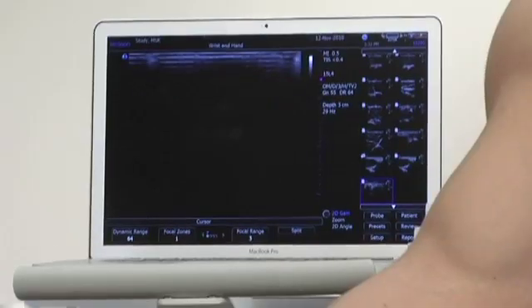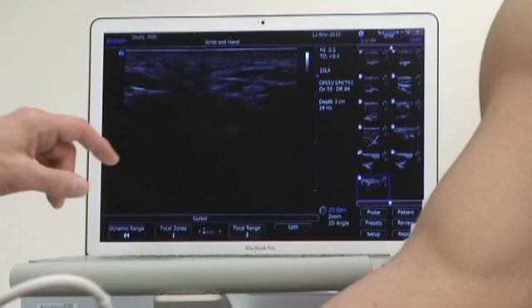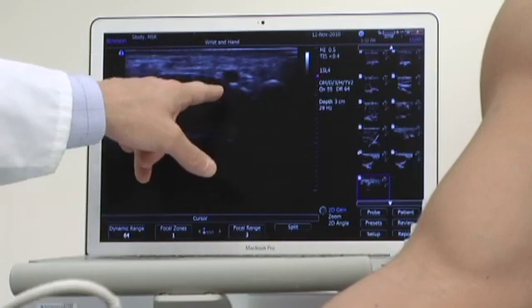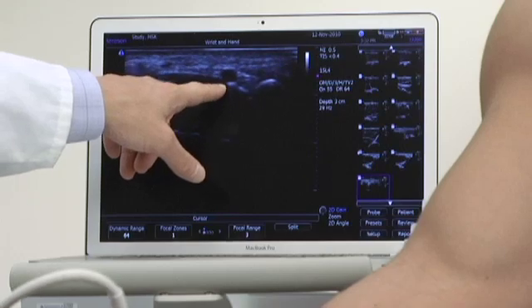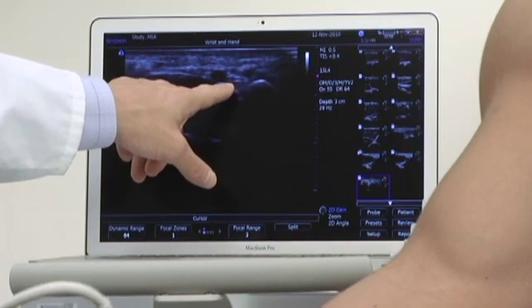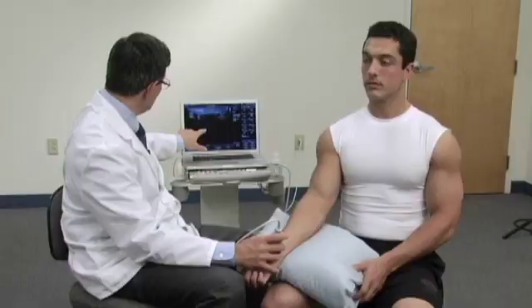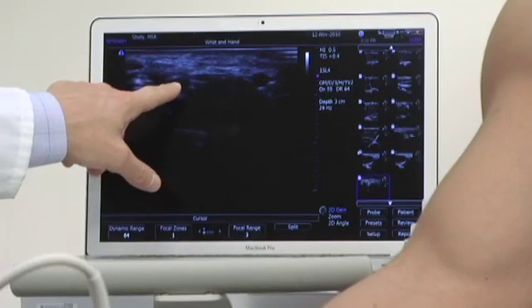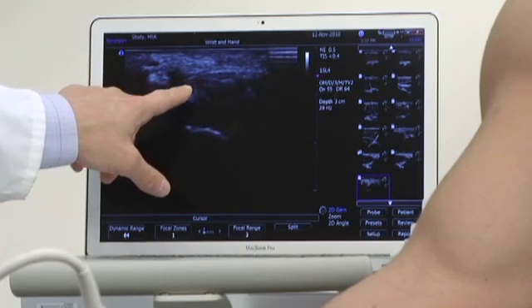First, we will identify some of the bony landmarks. Screen right will be the pisiform. This pulsating structure is the ulnar artery, and right next to it, right here, is the ulnar nerve. This is the flexor retinaculum, and here is the median nerve.